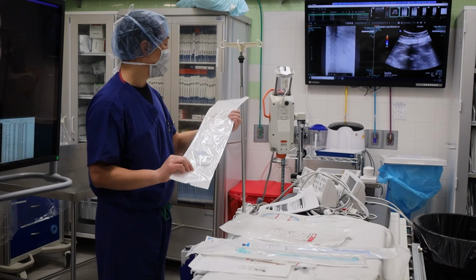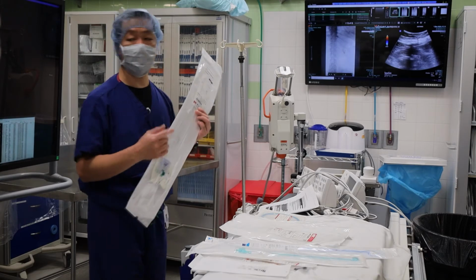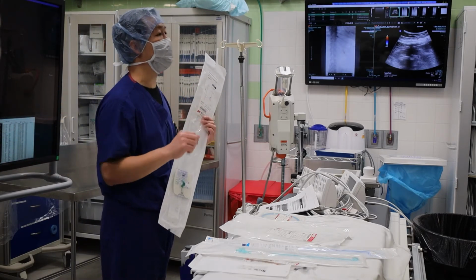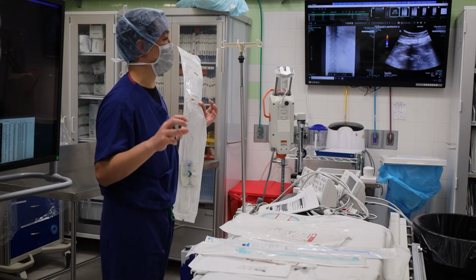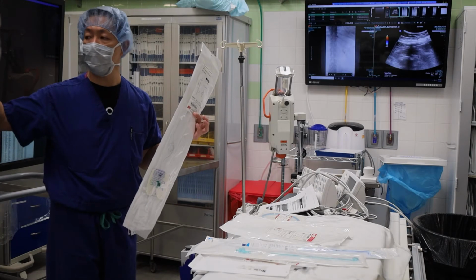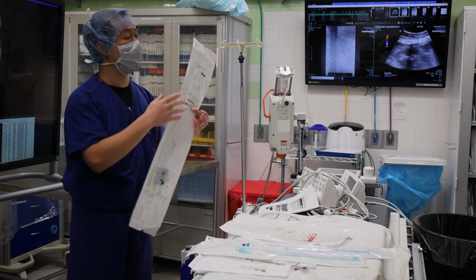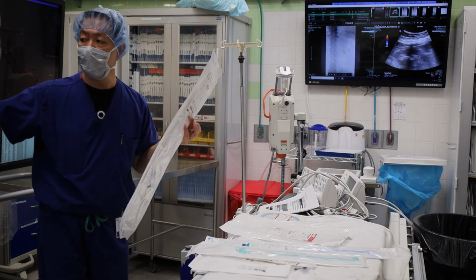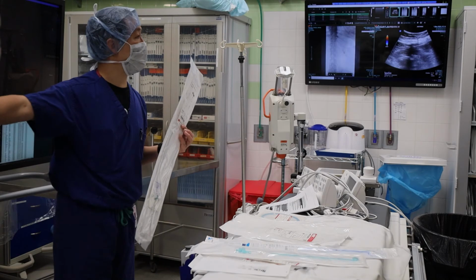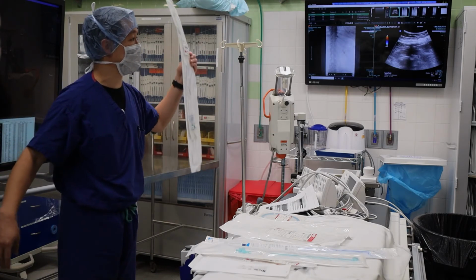And this is similar to the next topic of biliary stents. This allows you to have external drainage. It also allows you to put a cap on it, and now it's an internalized stent. And so for a lot of our patients, they've had a perc Neph, and now they're sick of carrying a bag. We convert it to one of these. It opens up the ureter all the way down. And depending on what was going on with their ureter, if it's a stone down there or a mass or whatever, it could be really hard to get this thing down.